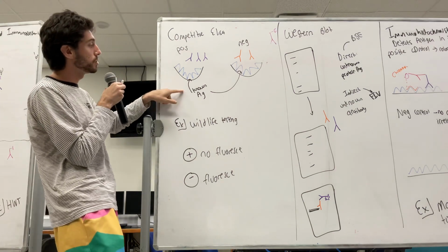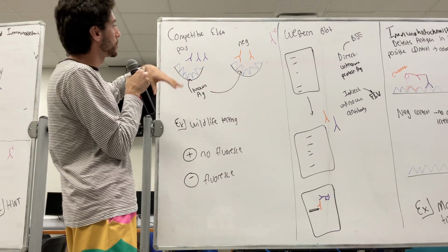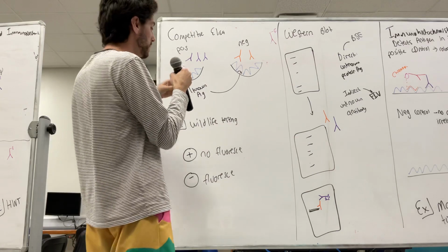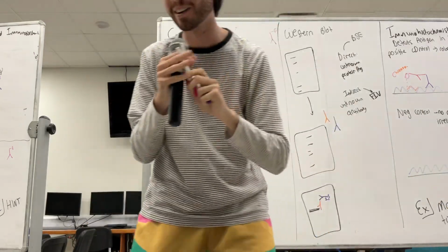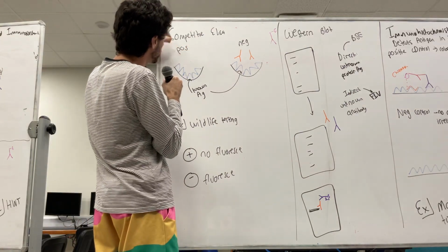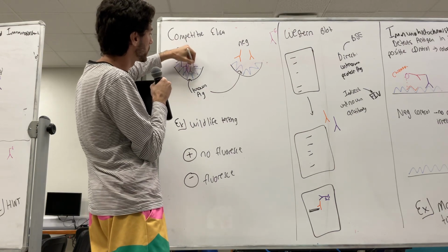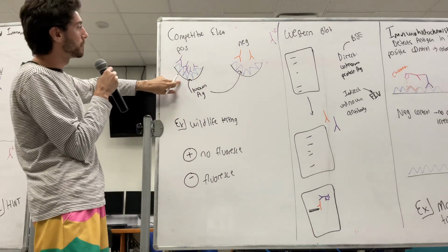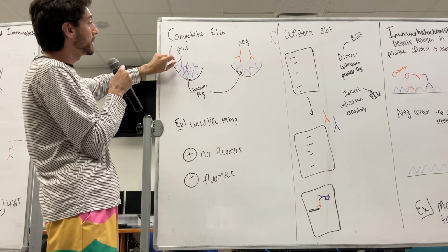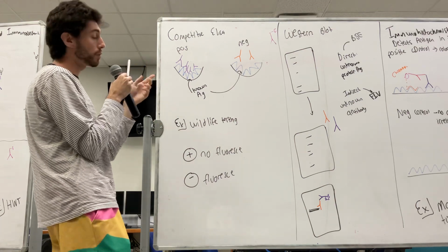We have a known antigen, and we line our well plate with the known antigen, and then we're going to run our patient's serum over those well plates. I think this is really cool actually. I'm going to run my patient's blood, and this is going to be a positive test, because this patient, we can just pretend it's a polar bear, is positive. The polar bear serum is then going to bind to this. When it binds to this, we're then going to run something with our fluorochrome over it.